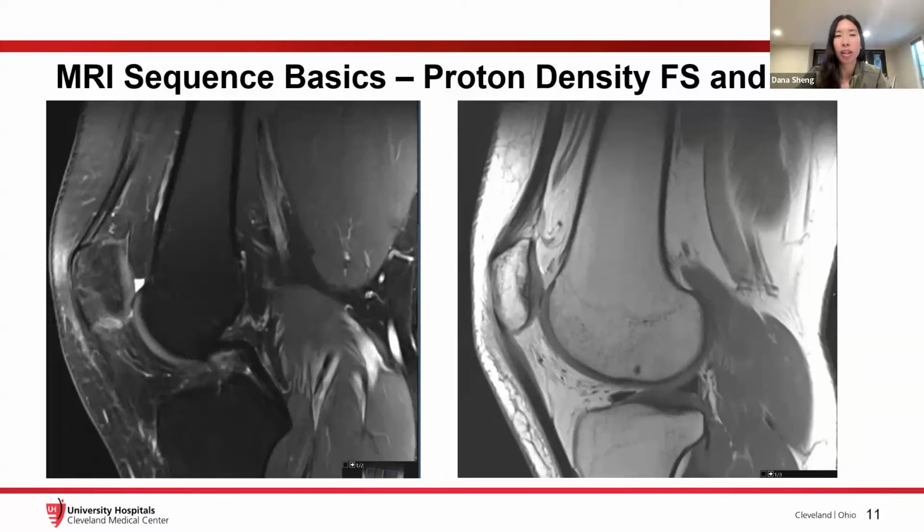Okay. And you talked about 3T versus 1.5T arthrogram. Is there also 3T arthrogram? There is also 3T arthrogram, which is probably the best of both worlds, I would say. The only thing you have to know, though, is that the arthrogram protocol does not have many fluid sensitive sequences. So contrast when we inject in the joint is only bright on T1 sequences.